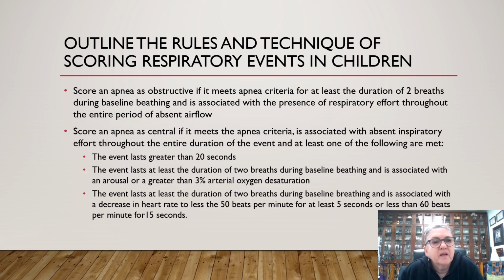Score an apnea as obstructive if it meets the apnea criteria for at least the duration of 2 breaths during baseline breathing and is associated with the presence of respiratory effort throughout the entire period of the absence of airflow. Score an apnea as central if it meets the apnea criteria and is associated with absent inspiratory effort throughout the entire duration of the event, and at least one of the following is met.